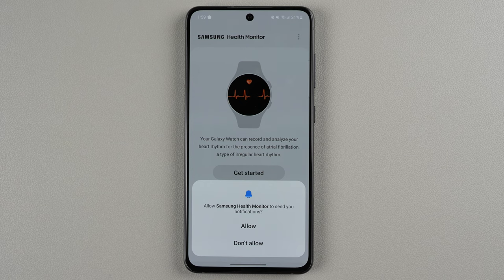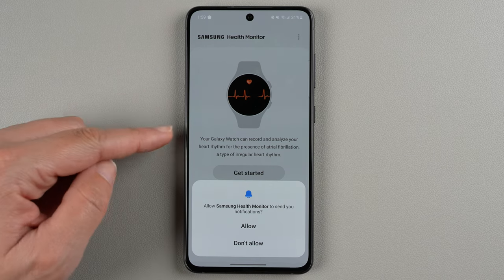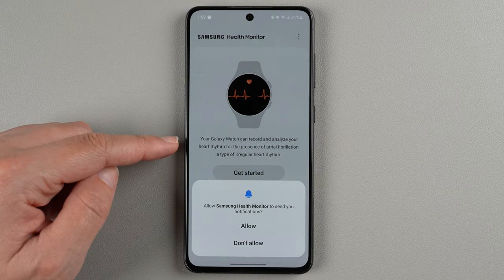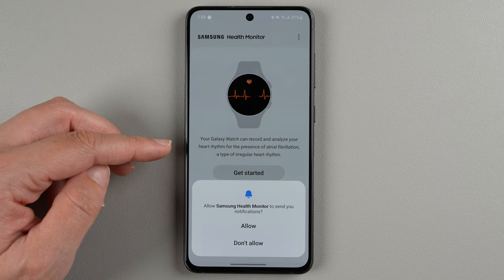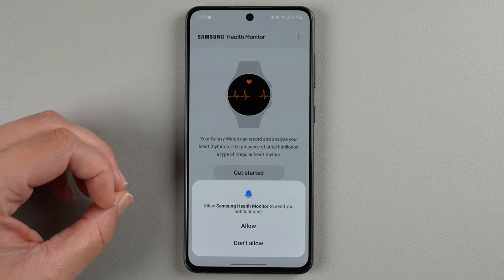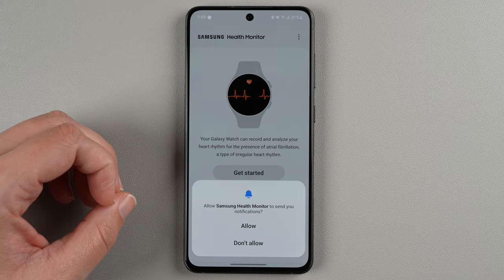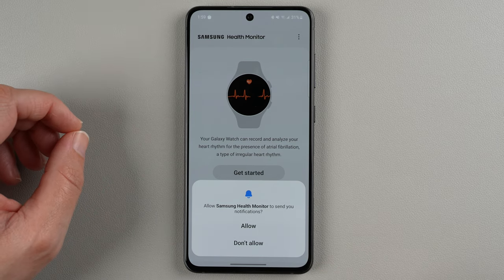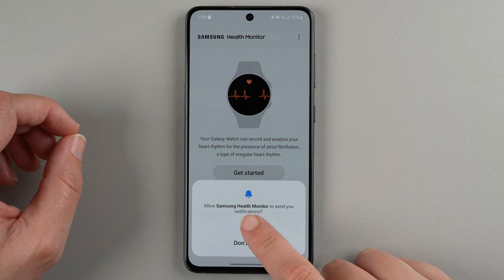Now it says allow Samsung Health Monitor to send you notifications. As you can see in the background, it says your Galaxy Watch can record and analyze your heart rhythm for the presence of atrial fibrillation or AFib, which is a type of irregular heart rhythm. This is basically allowing them to give you these irregular heart notifications. If you don't have any interest in that you can tap don't allow, but if you are interested, you'll want to tap allow.